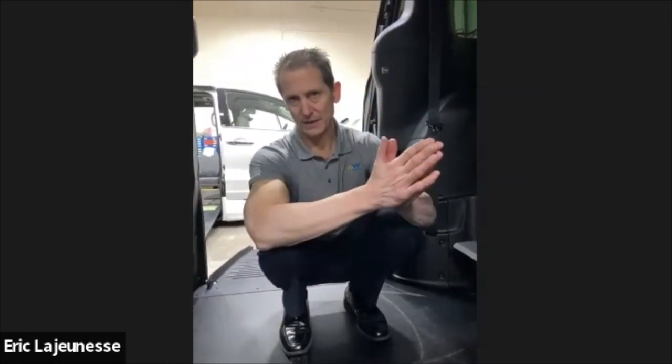It's really the manufacturer, like Electronic Mobility Controls. If you have an option A number 1 and they come out with an option A number 2, they usually keep parts and everything in stock for at least a 10-year shelf life. So if somebody had an electronic driving system 20 years ago, it's probably outdated by now, but 10 years, you're still in, because we've had people get into an accident, we've sent it back to Electronic Mobility Controls, and they can still install new servo motors, all that stuff.